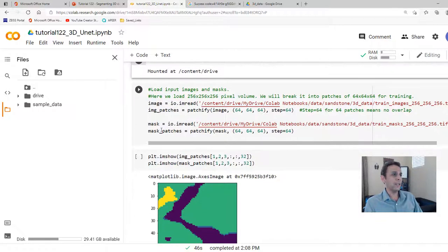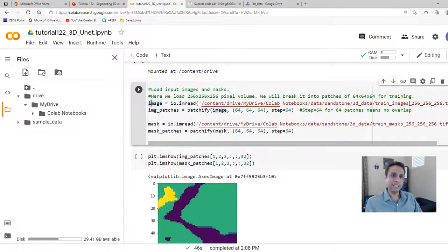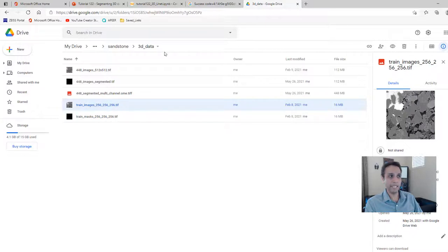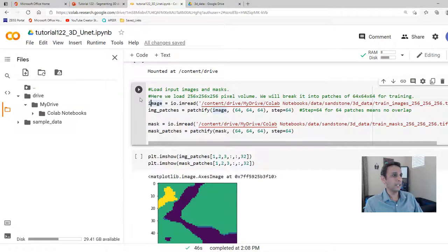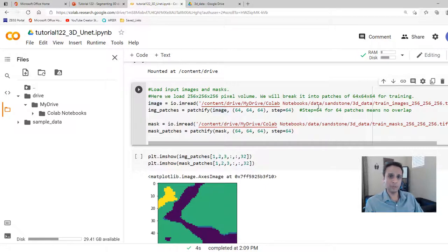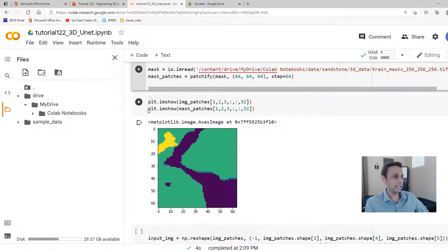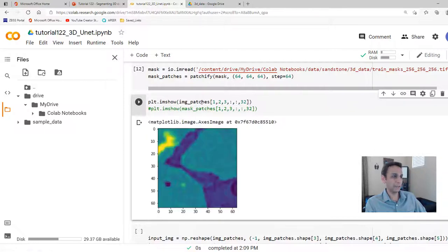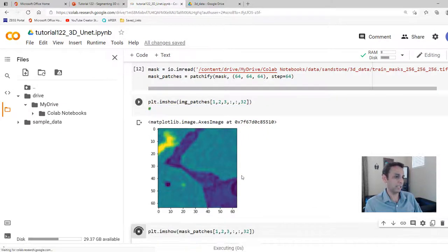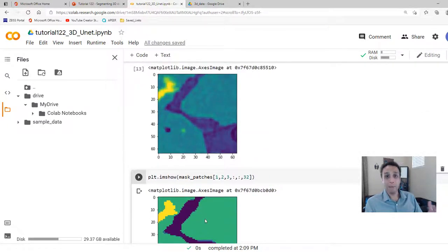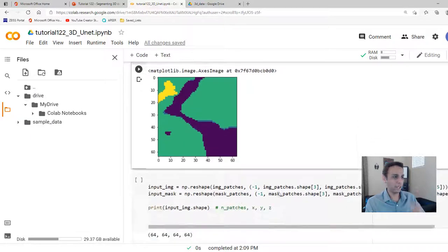Now let's read our image — the 256×256×256 TIFF — and then apply patchify to divide it into 64×64×64 patches with a step size of 64. We do exactly the same to the masks. Plotting a sample patch alongside its corresponding mask, we can confirm they match — an important sanity check to verify we're on the right track.